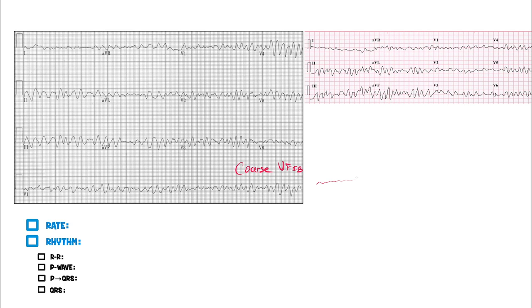You're not going to be worrying about rate at this point in time, but let's just go ahead for the sake of it and calculate something. Let's find somewhere about right here and about right here. It's about a box, maybe even less than a box. So let's say it's about 350 beats per minute around that. Fibrillation moves anywhere from 350 to 450 beats per minute.